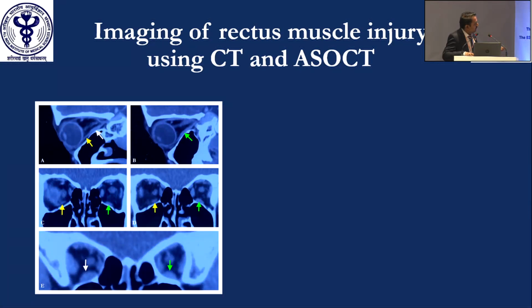So this is one scenario. The patient had an inferior rectus injury in the right eye, with right eye hypertropia. This is the left eye, the control eye, and this is a CT scan. People in India frequently do a CT scan as the first modality because it's a traumatic case. They don't go for MRI because they are not looking for the muscle. In the left eye as a control, you can see the belly has a gradual transition into a tendon, which is inserted onto the sclera.